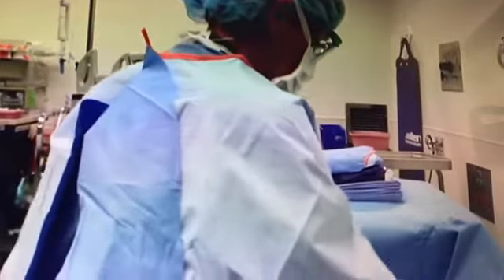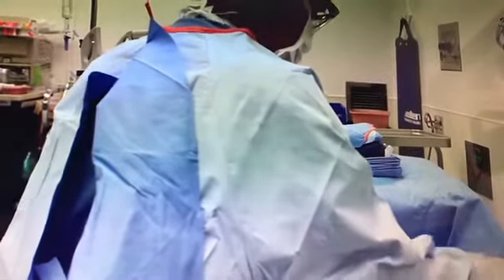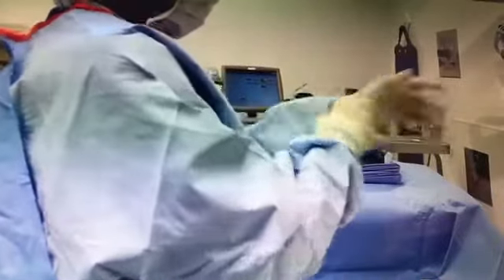After placing the gown on sterilely, the hands remain inside the gown, leaving the cuff of the gown covering the hands. The glove is then placed over the gown, and the hand is then brought through the glove without exposing the outside of the glove to the skin of the hand. This process is then repeated on the opposite side of the hand.